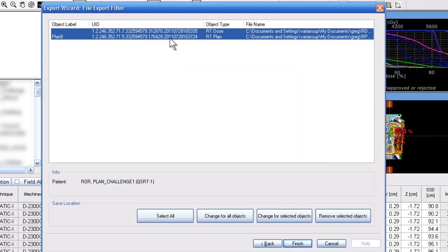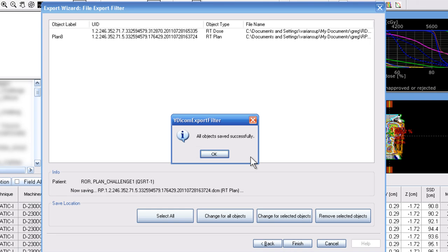Those files should be selected. If they're not, go ahead and hold the shift key down and select both those files or just say select all depending on what version of Eclipse you're running. And then just say finish.